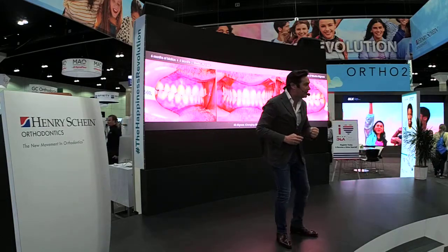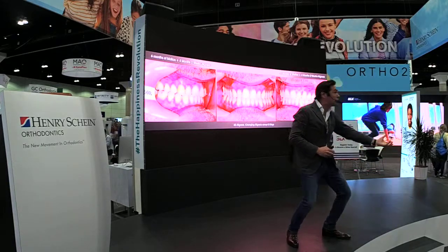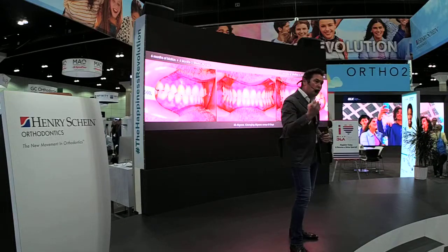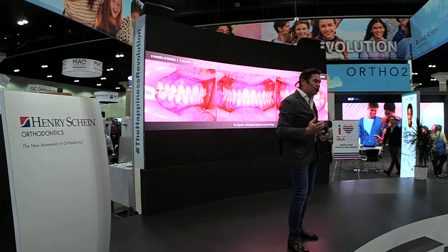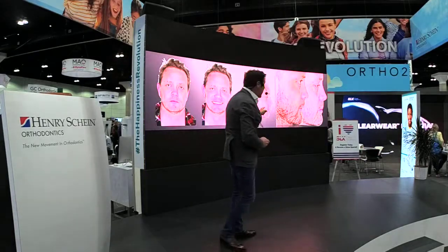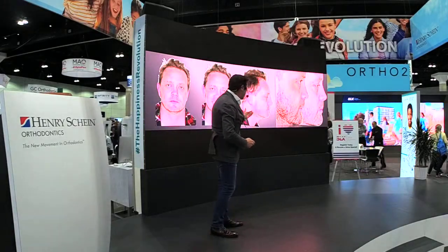This is what we expect, to generate a scenario of class 1, to accomplish a class 1, and to generate a scenario in which we are able to solve the class 2 with a short treatment of aligners. So this is the scenario that we accomplished, in which the patient now is much nicer.